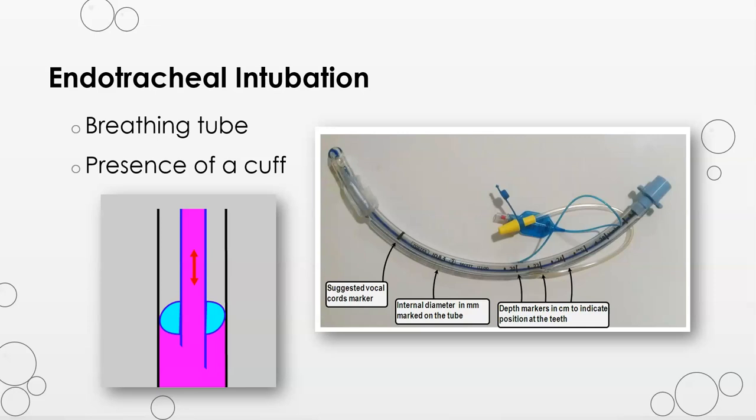First, it seals off the trachea. Therefore, air entering the tube cannot escape around the tube. The full tidal volume should then be delivered to the lungs. The cuff also assists the tube to remain in place. And lastly, the cuff protects the airway should the patient aspirate gastric contents. The cuff pressures are checked often by respiratory therapy, as maximum volume delivery is key.